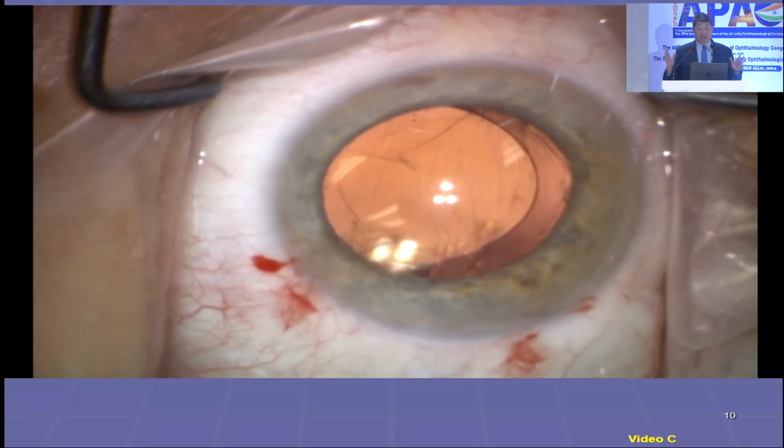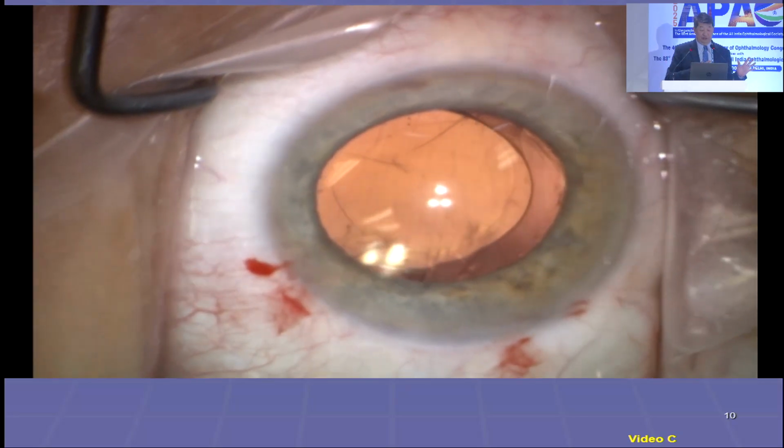Okay, so this patient came for the other eye surgery. The doctor referred for the other eye. And I've pretty much got 3 clock hours of zonules. I've decentered the lens. Can I just push it back and... MR, I'm going to refer this patient now to you.